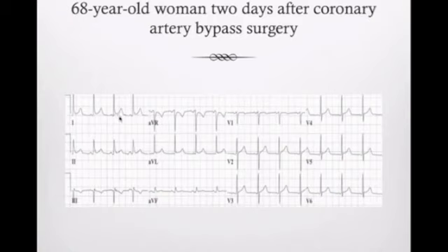We got ST segment elevation in 1. All right, got some depression in AVR. A little bit here, a little bit here. So most of our medics would be like, I don't know what's going on with this. Okay, 1, really no 2 contiguous leads. All right, now keep that EKG in mind, right?